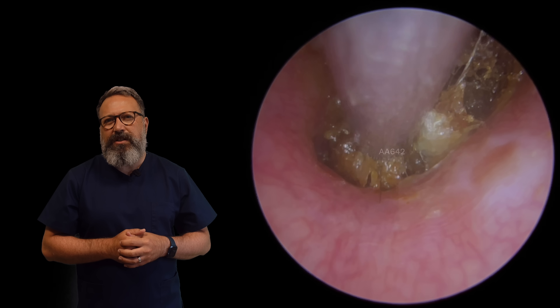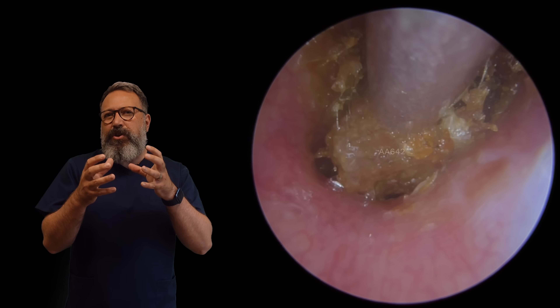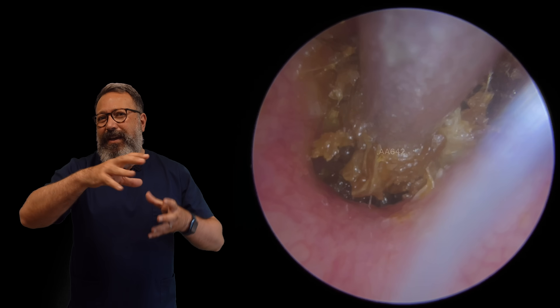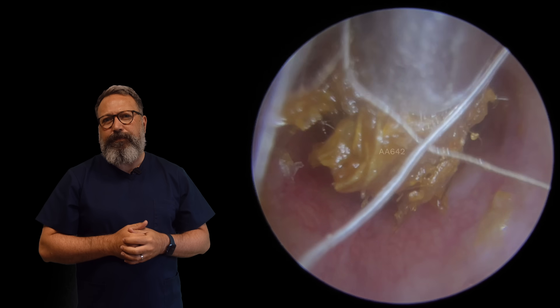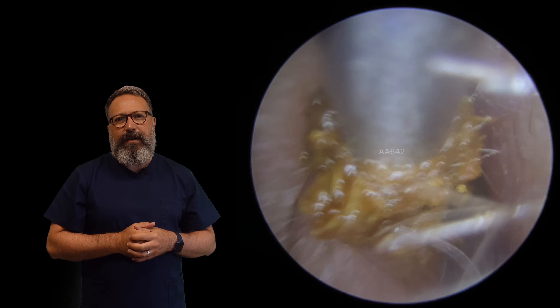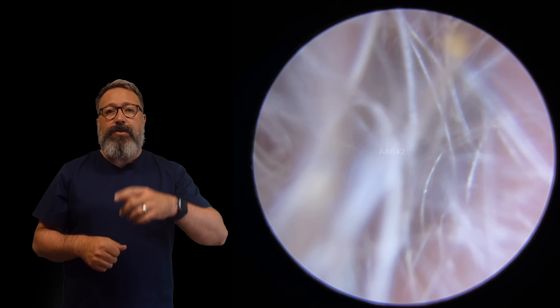It's not quite as solid as I'd ideally like — I'd really like this piece to be just a little bit more solid so that when you lift it, it brings big chunks out. But you can see as we're lifting it, it's just breaking apart, teasing it apart. There we are — another big chunk coming away, and out that comes.